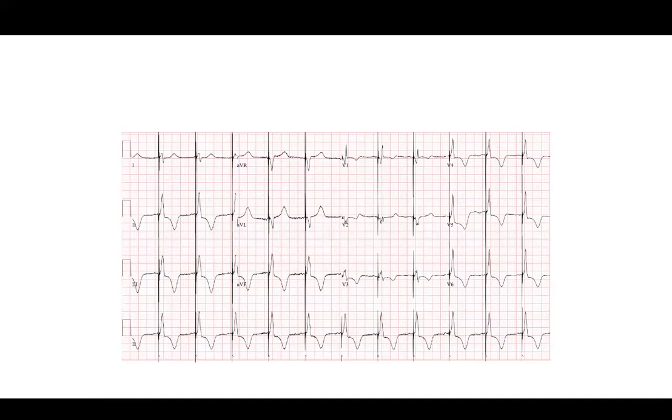capture. And this made me think about whether I would just have to program every single left bundle pacing lead that I put in, instead of the true bipolar from the tip to ring, to just unipolar pacing. The capture thresholds were pretty good as well. I think this is at around 1, if I remember correctly. It's either 0.75 or 1 on the Medtronic device.